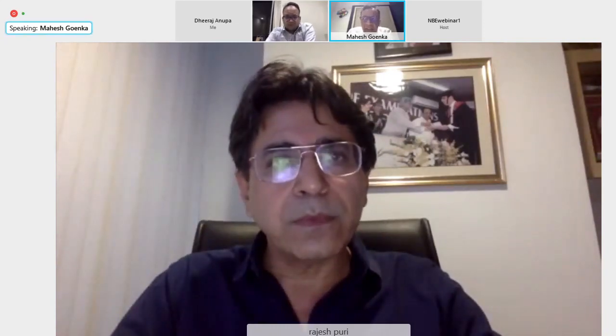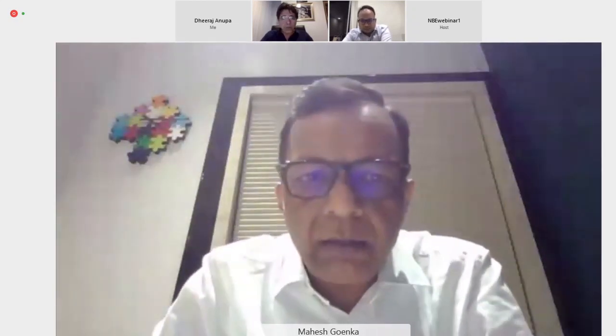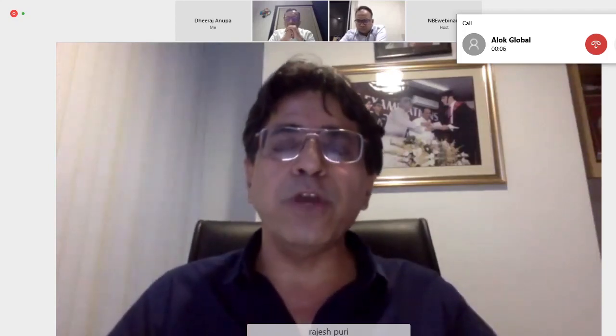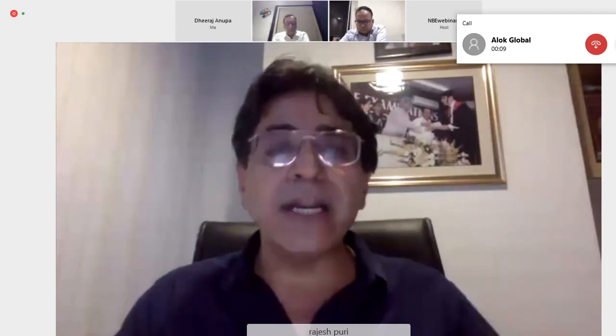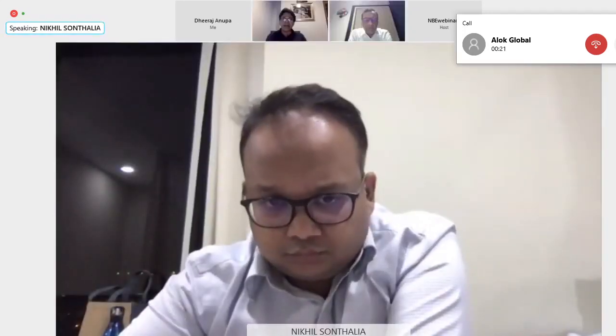See, Rajesh, there has been some debate about whether these criteria are suitable for the Indian population. So do you think that all these criteria are true for the Indian population as well for diagnosing mild chronic pancreatitis? Very good question, sir. This question was raised because there are many changes seen in Indian patients who are smokers or alcoholics. The important thing is you should have a pre-test probability. The patient should have pancreatitis. If the patient has a definite pancreatitis and you find these changes and you find 4 criteria, then yes, you follow these patients and the probability of getting chronic pancreatitis is very high. We don't have any data to say that these are Indian criteria. Still, we have not developed any Indian criteria to say that these are different from them. The important thing is a definite history of recurrent pancreatitis should be there.